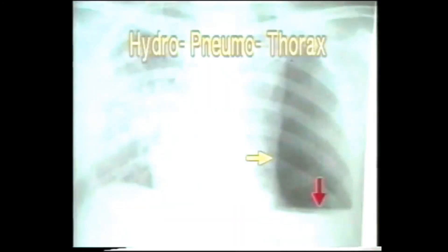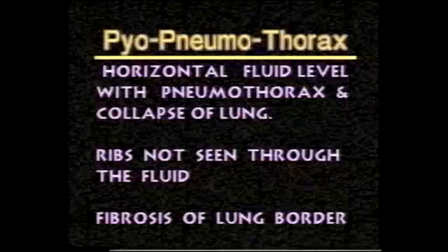This is another X-ray showing hydropneumothorax on the left side. Note the fluid level, the air above it, and the collapsed lung. In the close-up view, the red arrow shows the fluid level and the yellow arrow shows the collapsed lung border. Whenever there is a horizontal fluid level with pneumothorax and lung collapse, it is a hydropneumothorax or pyopneumothorax.